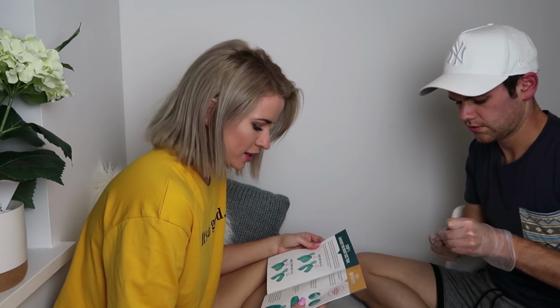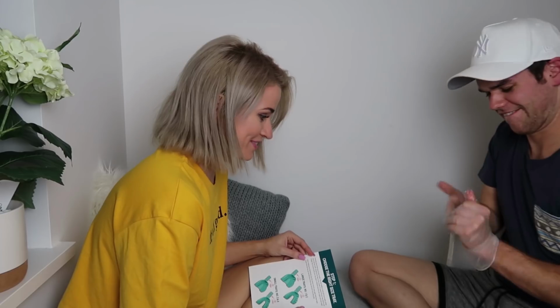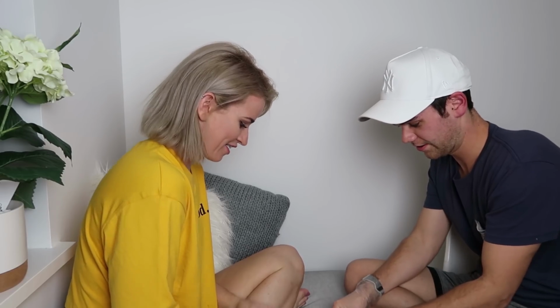Which you would know if you read the instructions. Yeah, once you begin mixing, you only have 60 seconds. Finally! Yeah, it's going to mix it. Like that, do you reckon? Yeah, I reckon.